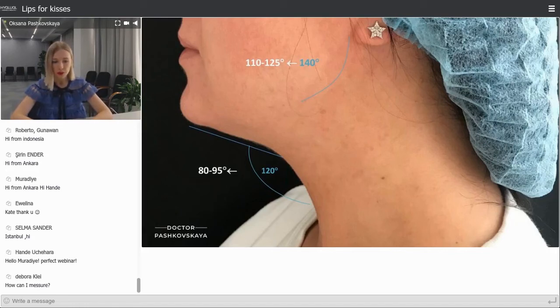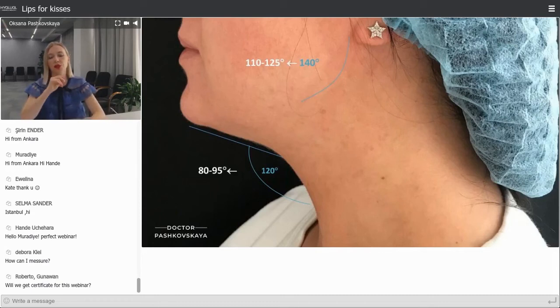And also one of my favorite procedures, because I see an immediate result, is increasing the chin apex, because doing this we could decrease the chin-neck angle. Yes, you see it here. We could decrease that angle and make the profile more fit, more fresh, and younger overall. So if proportions are not against it, you could put additional volume in that zone and make the profile more fit.